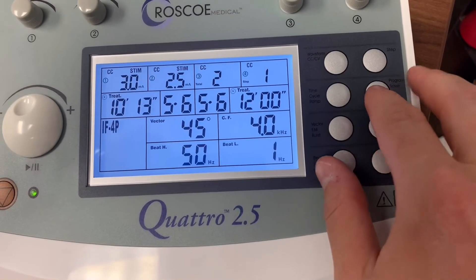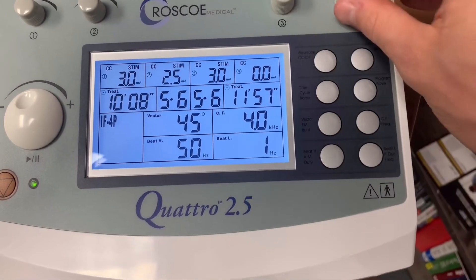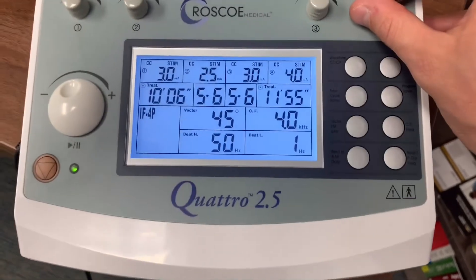So now we're going to increase the intensity. You can see now we're saved here, and we're adjusting it back up.